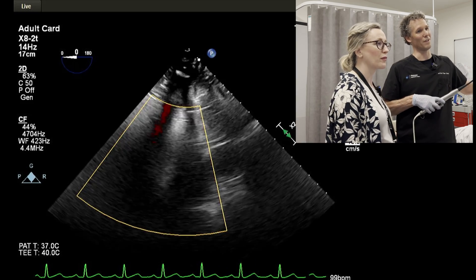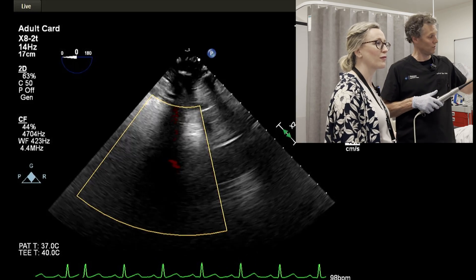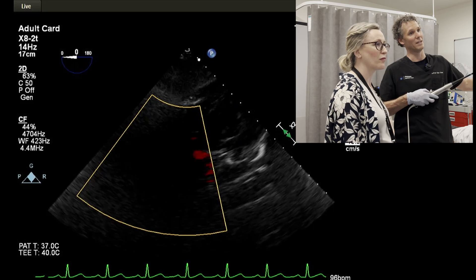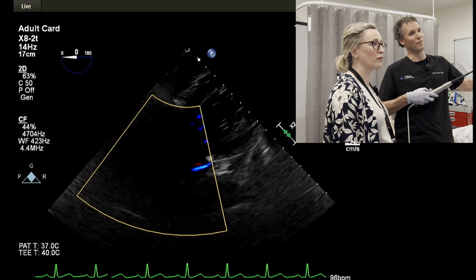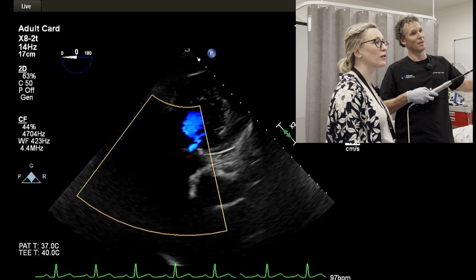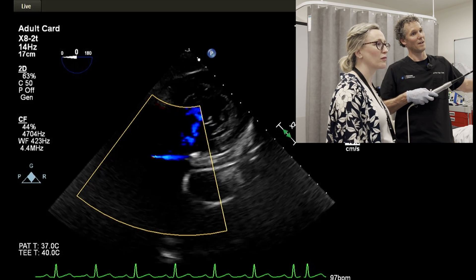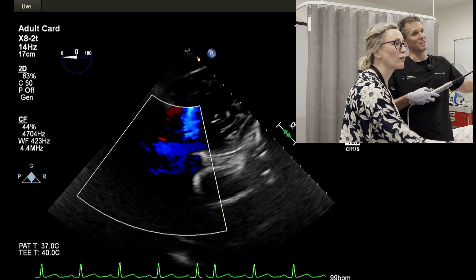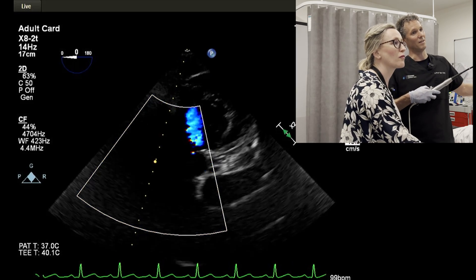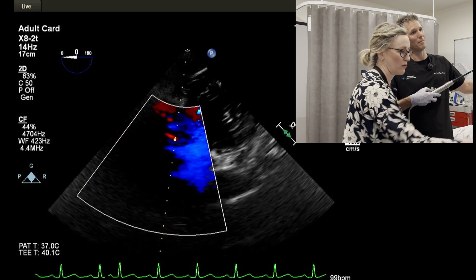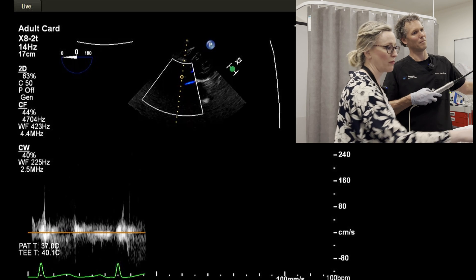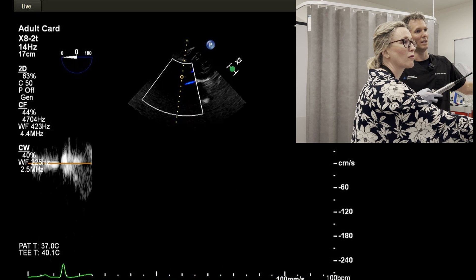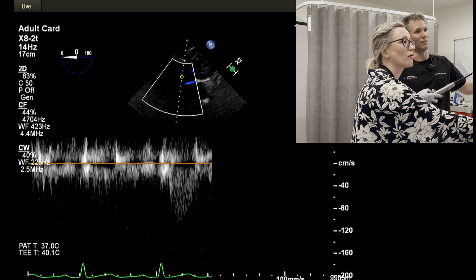Obviously you can't see a lot of the aortic valve. If I lose it, I'm going to again advance, full anti-flexion, gently pull back, trying to find that five chamber view. And I think if we were to put the continuous wave through there we'd see something. We'll move the baseline up, turn down the scale — and there's the flow through the aortic valve.